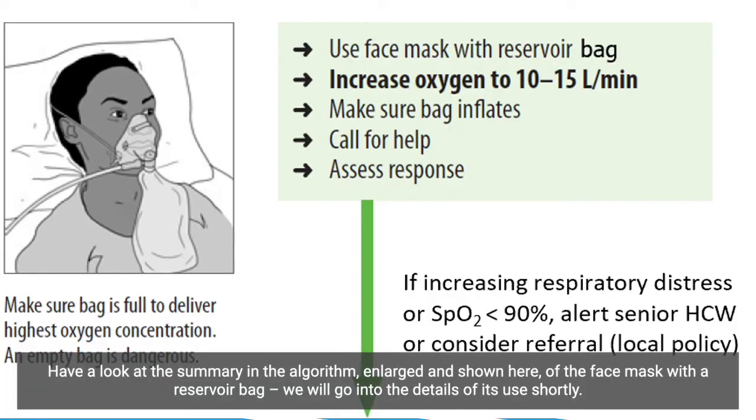Have a look at the summary in the algorithm, enlarged and shown here, of the face mask with a reservoir bag. We will go into details of its use shortly.